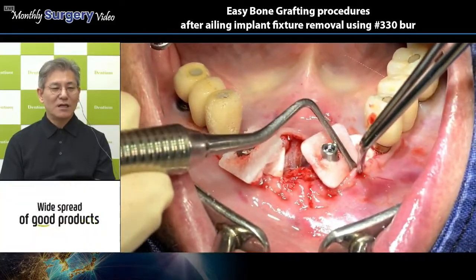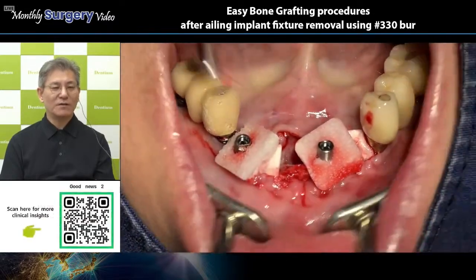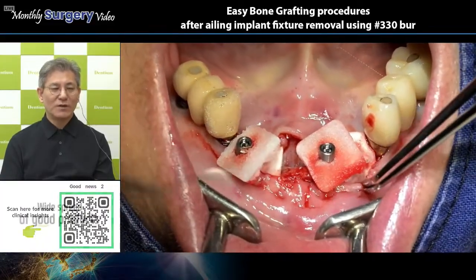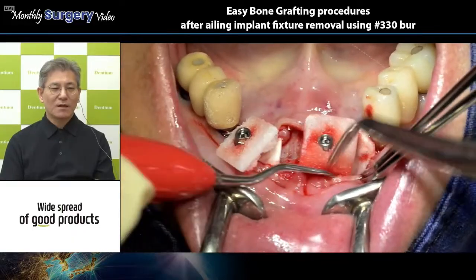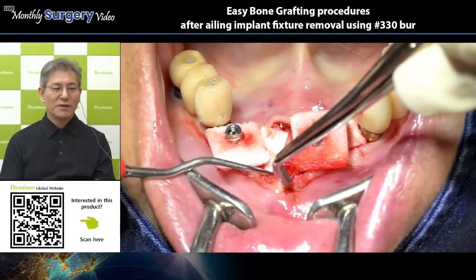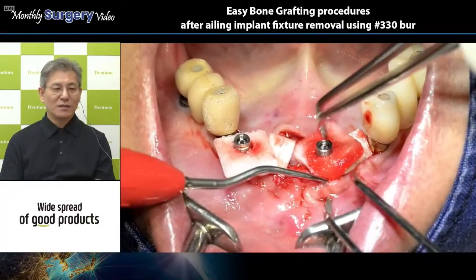Like an engagement ring, this collagen graft was applied on the top portion of the comfort cap. Why use this collagen graft additionally on the upper side of the collagen membrane? Okay, now he makes a small periosteal releasing procedure using this periodontal curette.